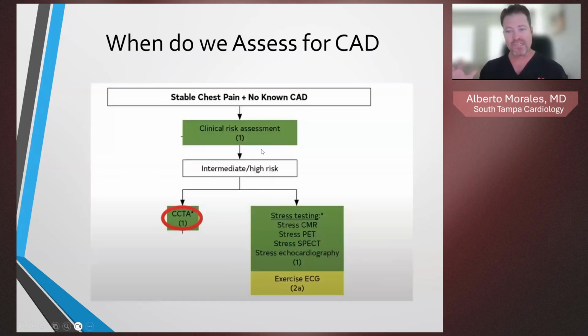So this is a typical scenario in cardiology. We typically wait for somebody to have symptoms before we evaluate them. And you can go down various pathways, right? Stress testing, CT. I obviously prefer CT, but let's go over stress testing.